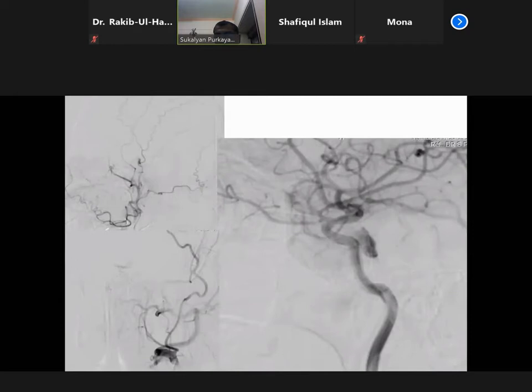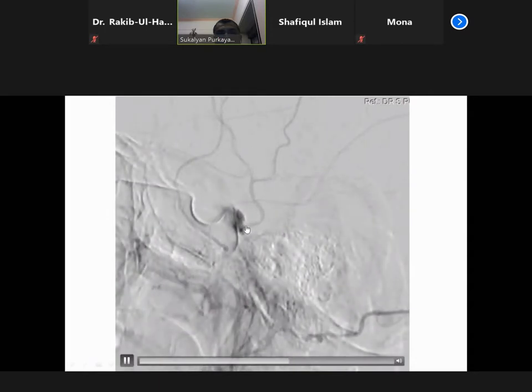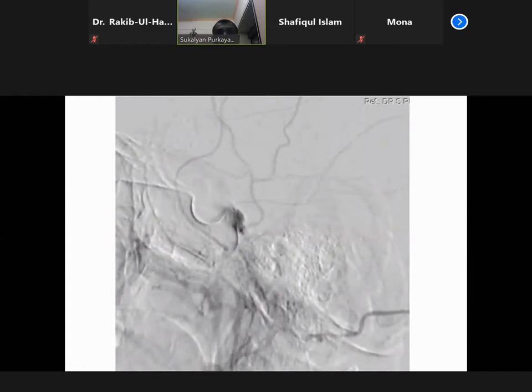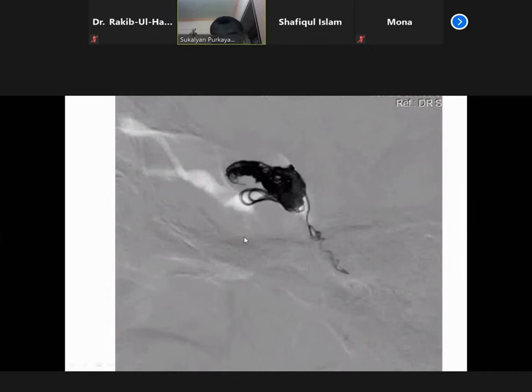Now, this is the angiogram. You can see that there is a very slow flowing fistula from the external carotid system as well, and it is going into both the superficial and superior and the inferior ophthalmic veins and supplying the fistula. So obviously, if your cavernous sinus, inferior petrosal sinus is blocked, either you have to go from the anterior aspect, or if you try, you can definitely dig into the inferior petrosal vein and make a route.